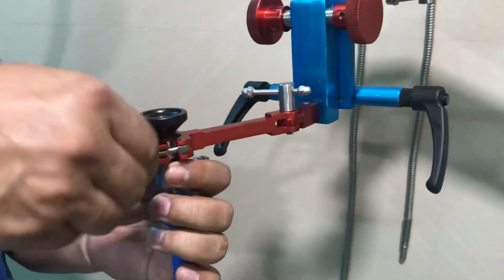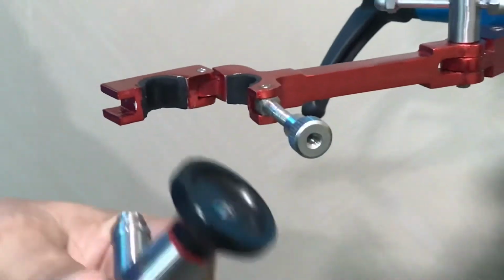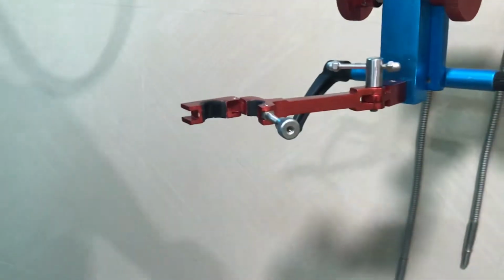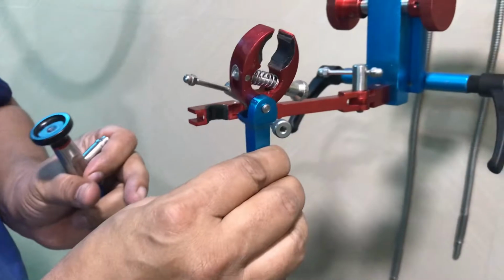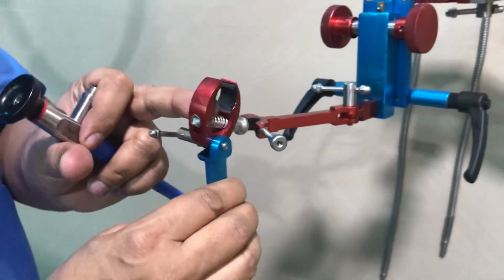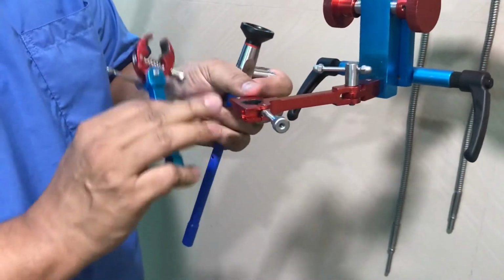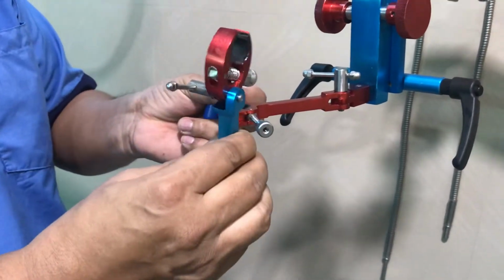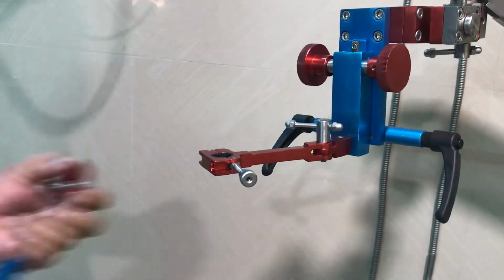If there are any other endoscopes, meaning endoscopes like these, there is another attachment that is called the magic clamp. So this can grip any type of endoscope. This is exclusively for the Karl Storz endoscope. This is for holding any other endoscope. So we will see how we can grip it.